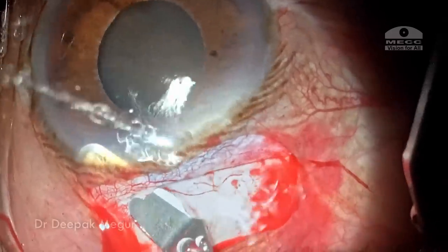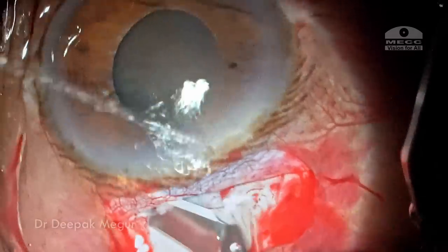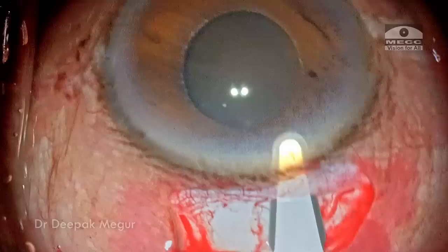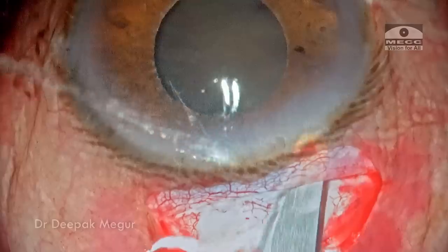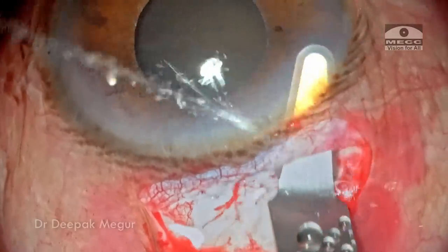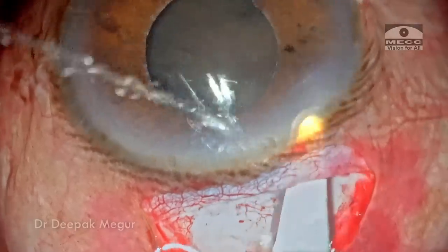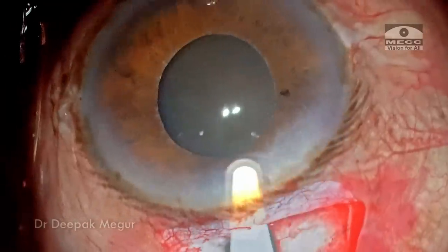Once we get the right plane, it's quite simple, easy and fast. I'm going to create this tunneling on either side of the center point, and the internal entry is going to be about 0.5 to 1 mm bigger than the external entry. The internal entry is always going to be parallel to the limbus — in a U-shape, contrary to the frown-shaped external incision. My assistant is irrigating to ensure that my visibility is not compromised as the tunnel is being made.